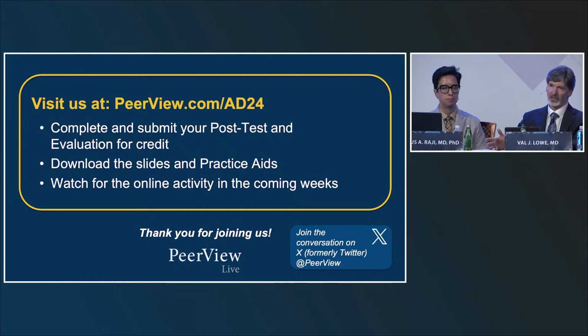So we tend to use FDG PET as sort of the first blush, the first approach to what might be abnormal. Payment is easier for that test. And then after that, if we need to know specific pathologies, we would move on to the other two.